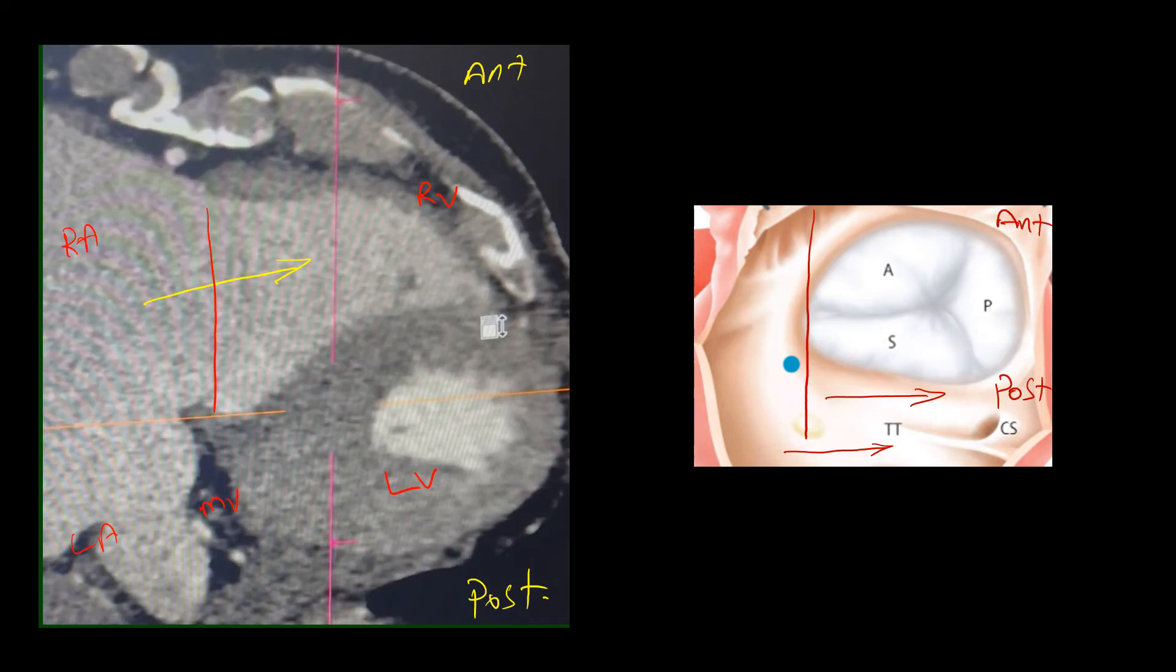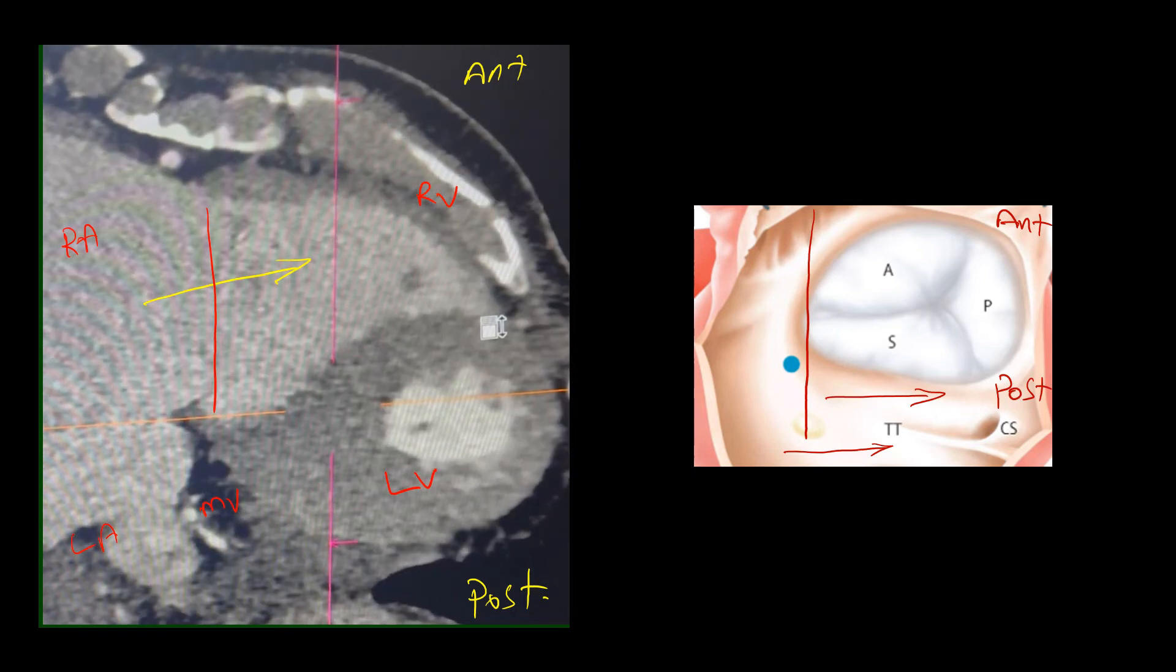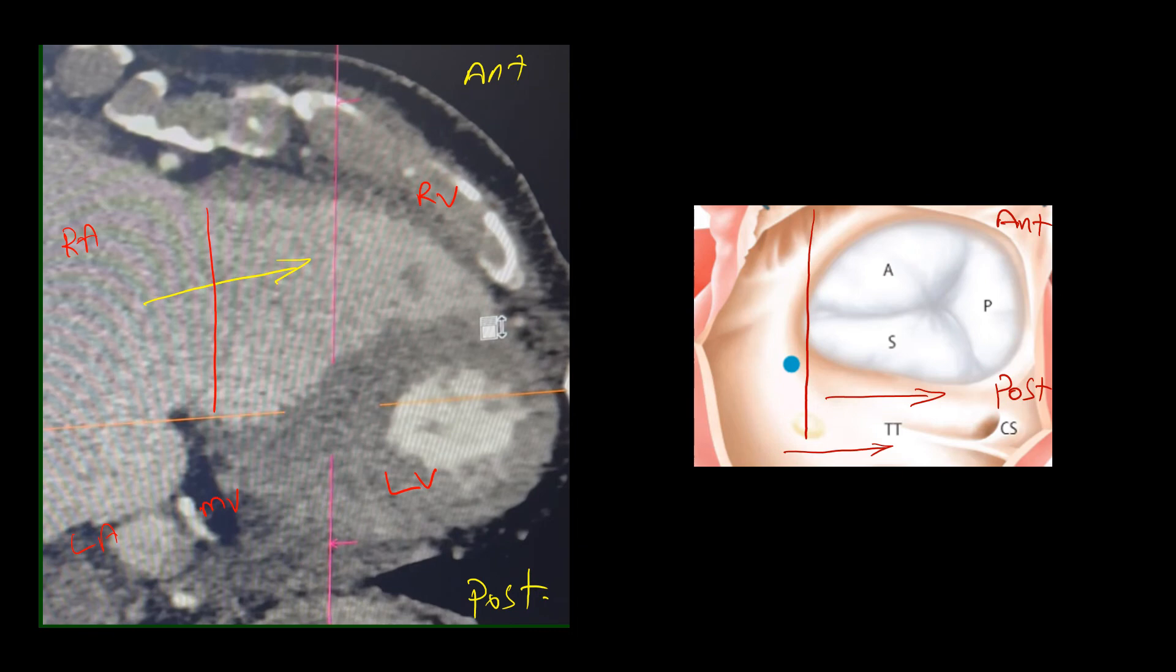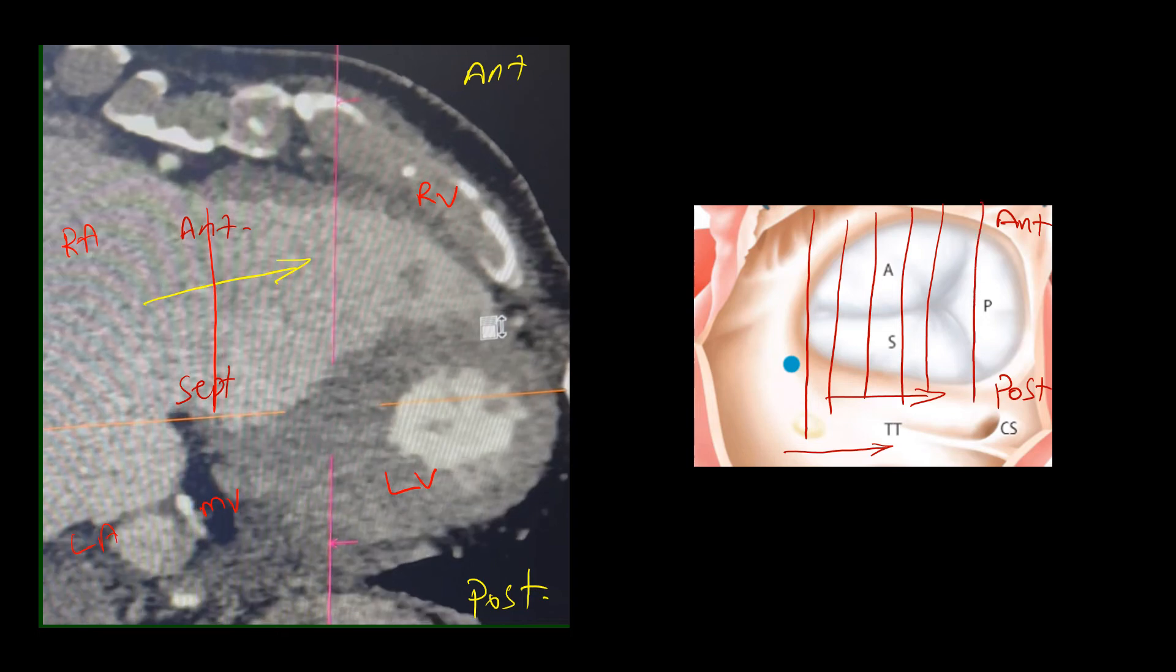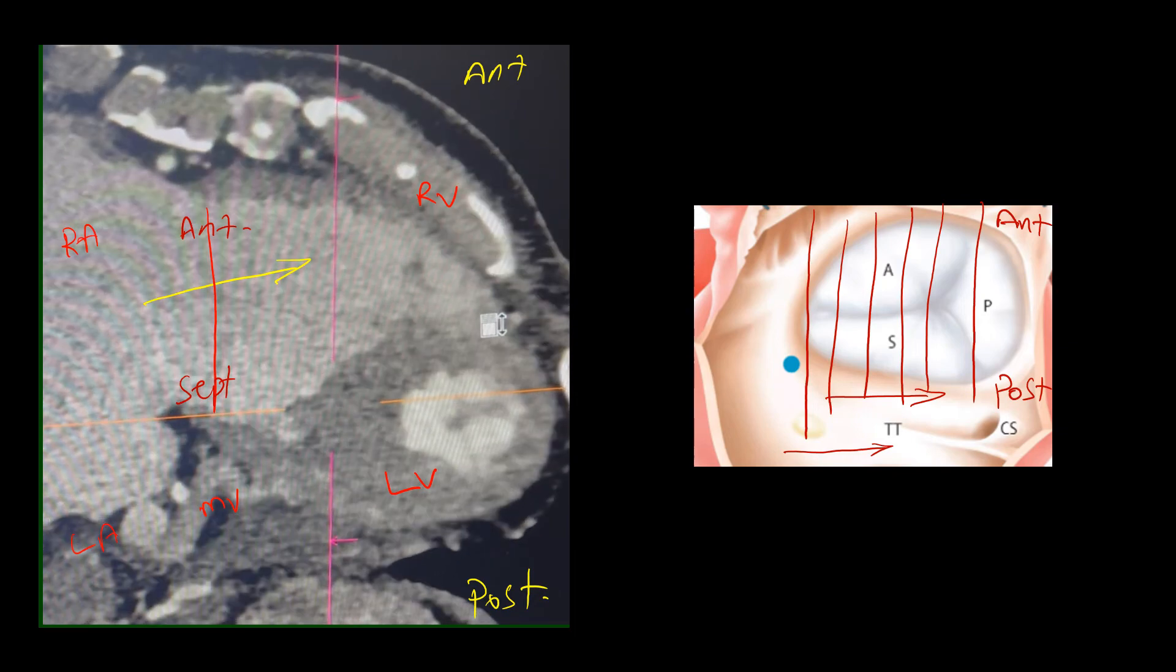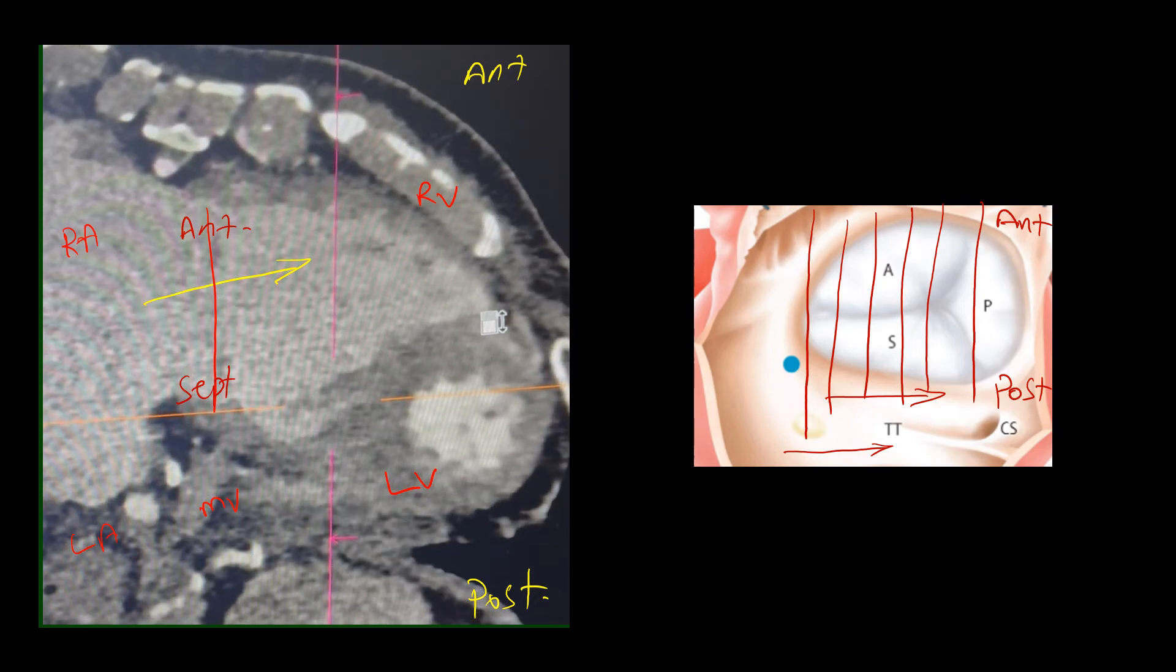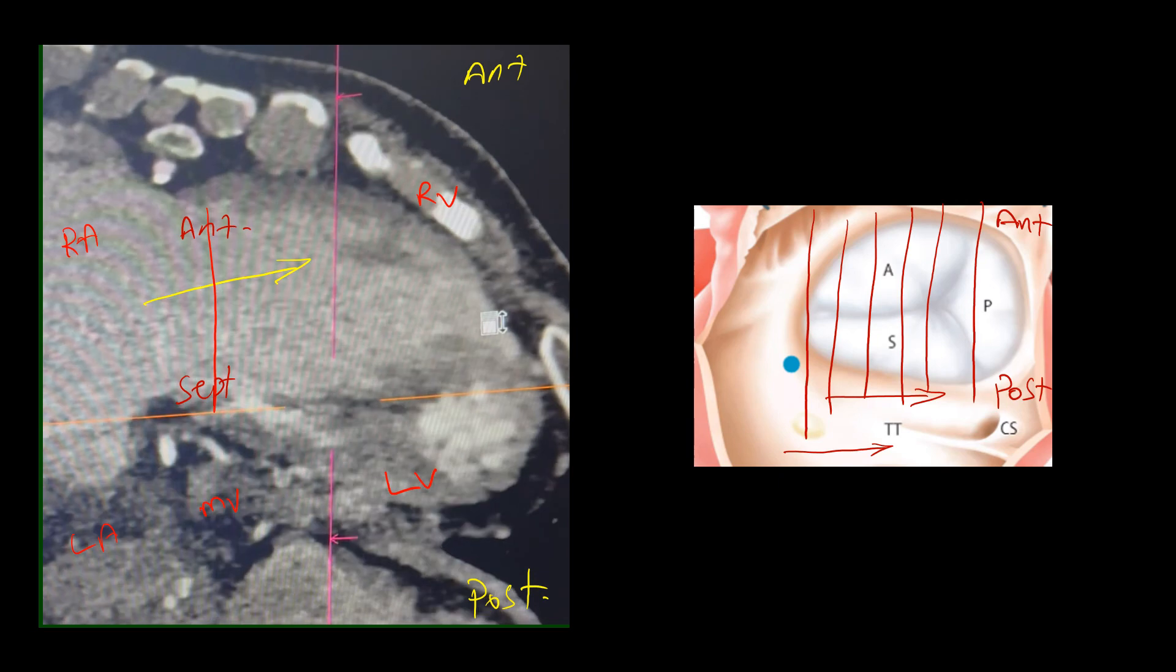As we scroll further down towards the posterior sections, we are moving further downward towards these sections. Here we should have anterior leaflet in view, and here we have septal leaflet in view. As we are moving downwards, we are going towards the posterior leaflet, moving further down. Still no sign of the pacemaker lead.